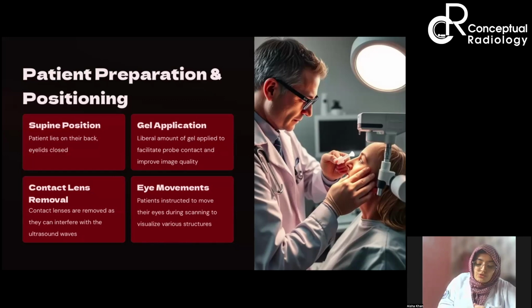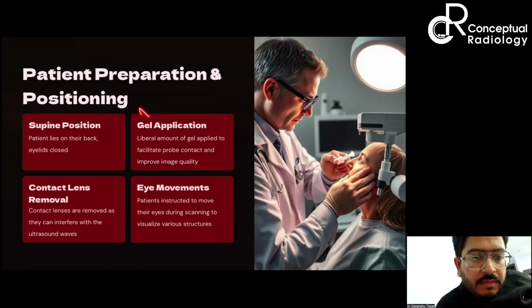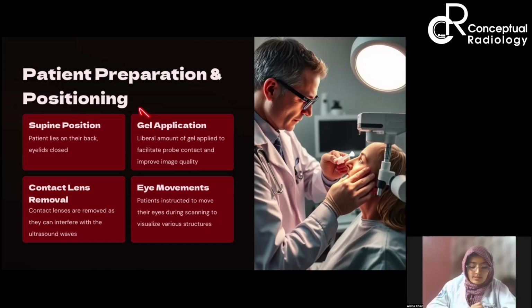अच्छा, gel application की बात करें तो in other places you might be working in maybe some resource depleted areas, so you might be trying to save on your gel, but ocular ultrasound में and certain MSK and superficial ultrasounds, I am giving you this lifetime advice कि gel application में don't have to fear away from applying lots and lots of liberal amount of gel, because that will give you a better contact. You don't have to apply that much of transducer pressure, and also the image quality is going to be much better. ठीक है, so gel बहुत सारा लगाना है इसमें.